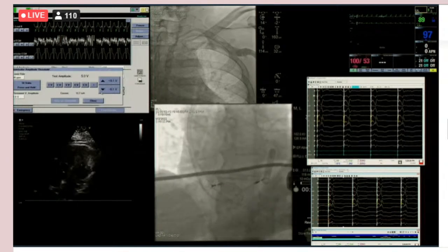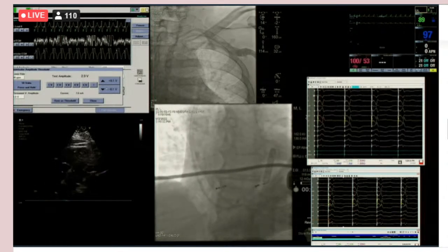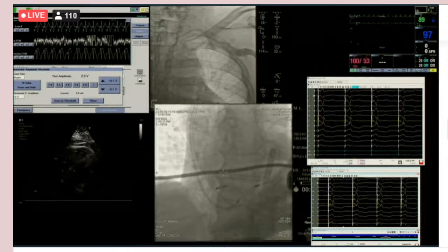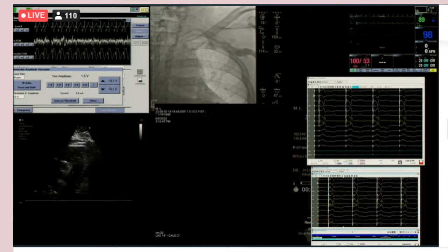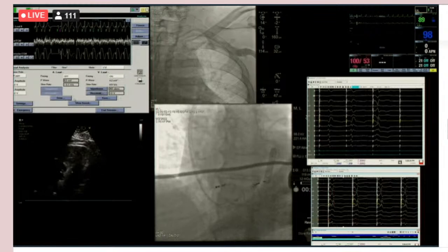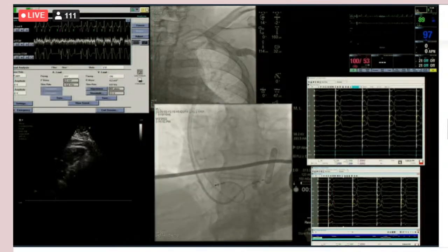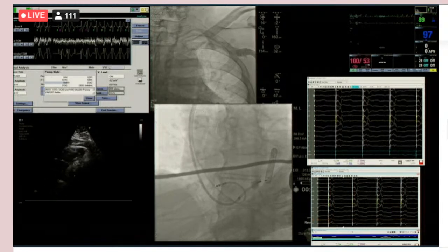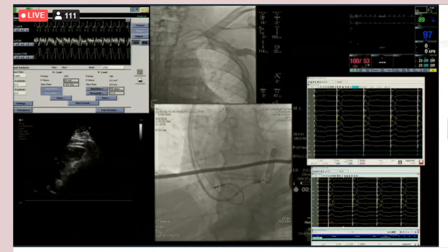So then that's going to bring me back to one of my other questions. Medtronic, I think, has the smallest diameter lead for this, whereas the other companies don't. They use their standard leads. Does this tie us into using Medtronic for all our cases, or do you think it's possible to use the other companies' leads to do this left bundle pacing? Well, I think that at the moment, Medtronic has an advantage over the competition.